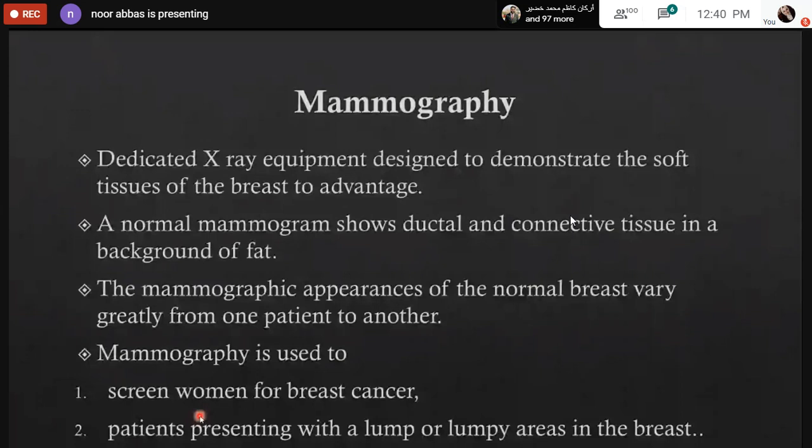The first step is mammography, followed by ultrasound on the area of abnormality. Here too the situation is reversed: any patient with a palpable lump, when you go through surgery, you will notice that the patient is sent first for ultrasound, before mammography, and this is generally not correct.